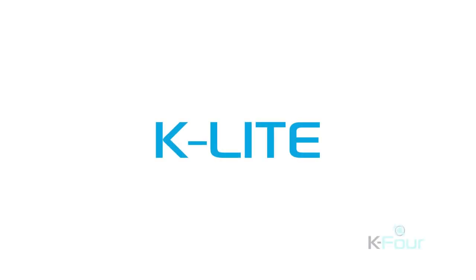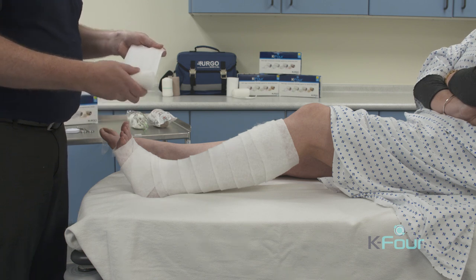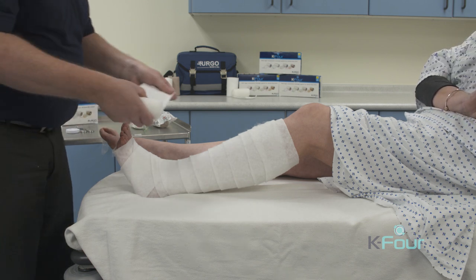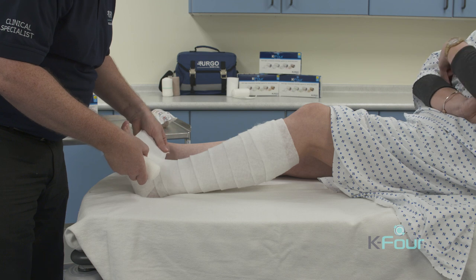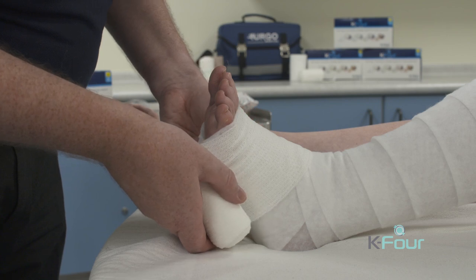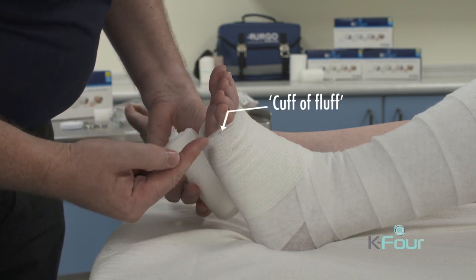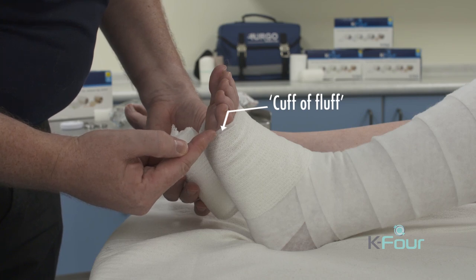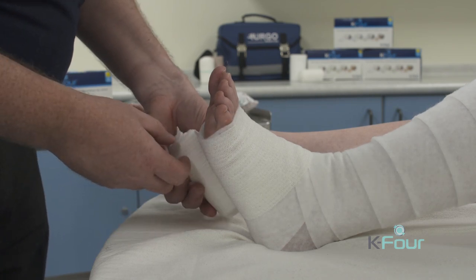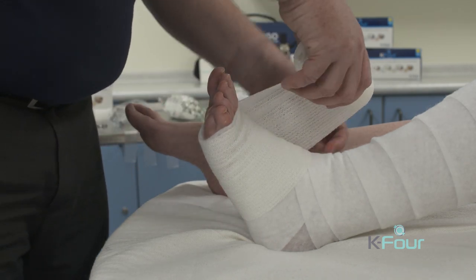The second layer is K-Light, a light conforming bandage with no compression. We apply it with enough stretch so it lightly grips and conforms to the limb. We follow the base of the toes with the bandage, applying it so that we leave a cuff of fluff between the skin and the edge of the bandage.